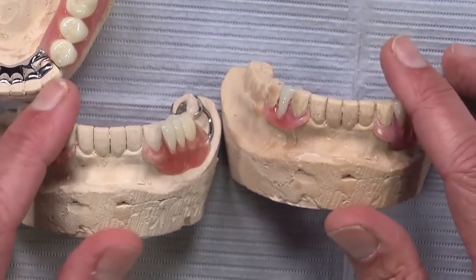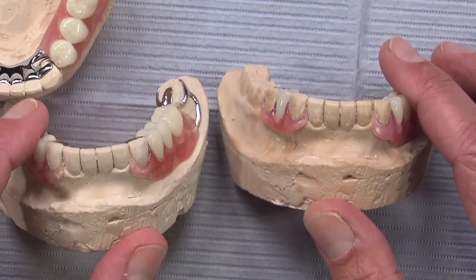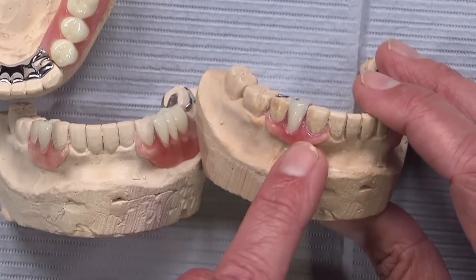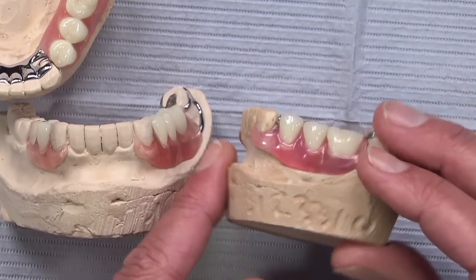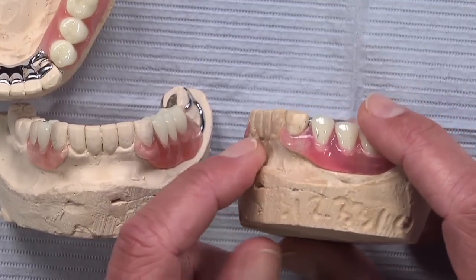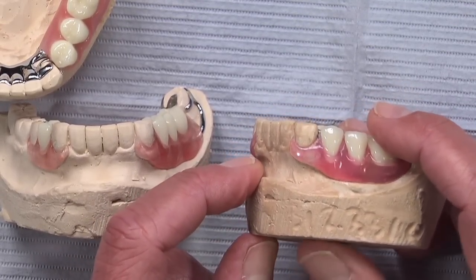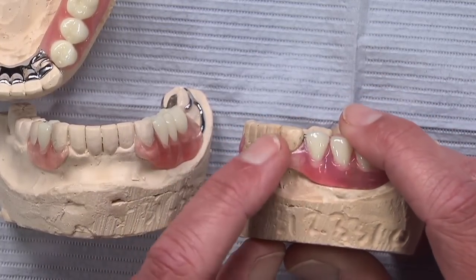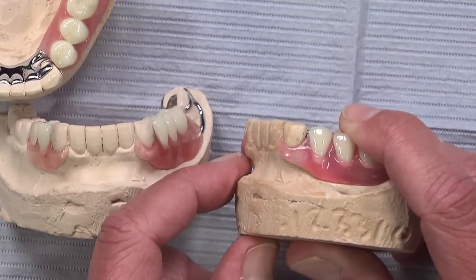We definitely receive cases as well where the tooth has no undercut. If the tooth is not very bell-shaped, if it doesn't get skinny around the cervical third, and there are certainly teeth that are shaped that way, you can create your own height of contour. So after delivery of the partial, you can still have an aesthetic clasp like this made, and then you can place composite above that.